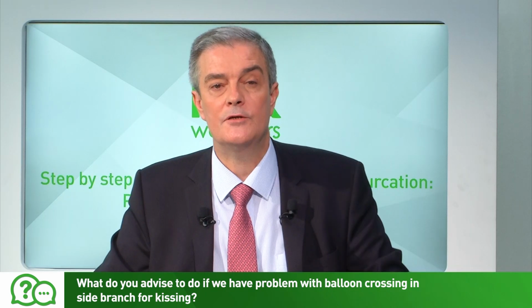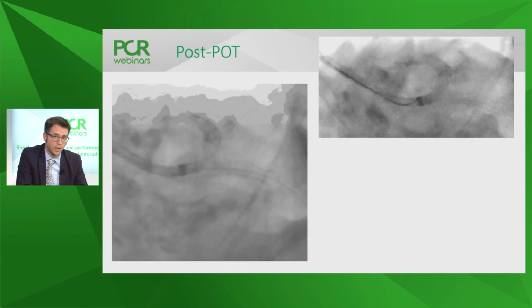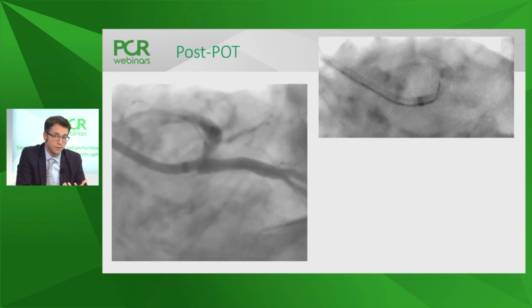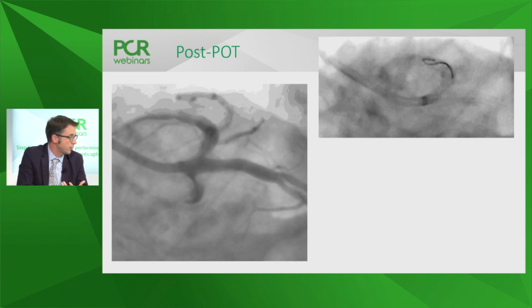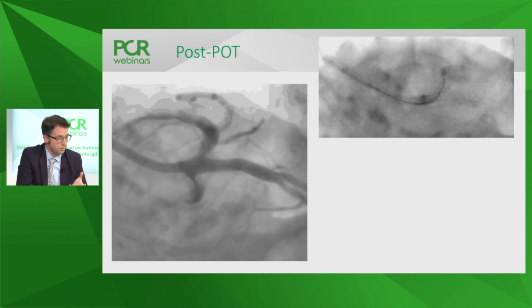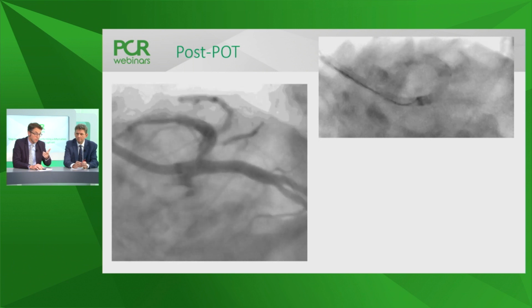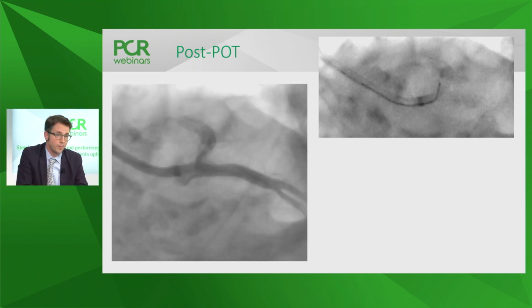Yeah. Next question, is the LAD ostium optimally dilated? But I think we come to that question now because after POT you are recrossing again. Exactly. So the POT has nicely expanded into the side branch, into the LAD, then facilitating for us a recross with a further wire. And so we can do that with really the reassurance that we're not going to be going under a strut. Yes. And secondarily, we're not going to be deforming or foreshortening the stent that was until this point underdeployed in the left main stem.